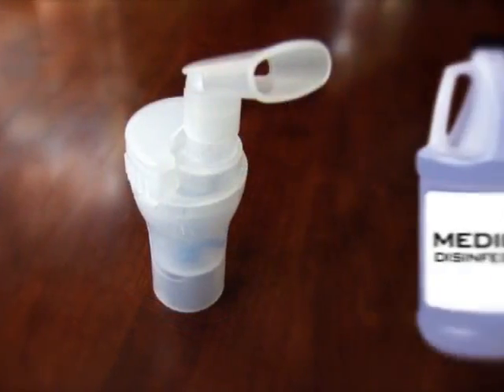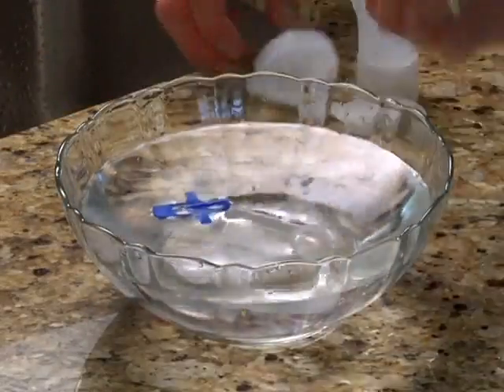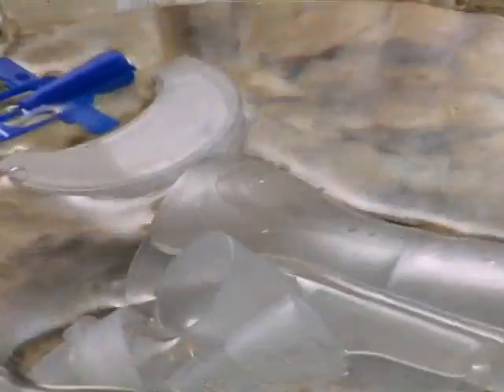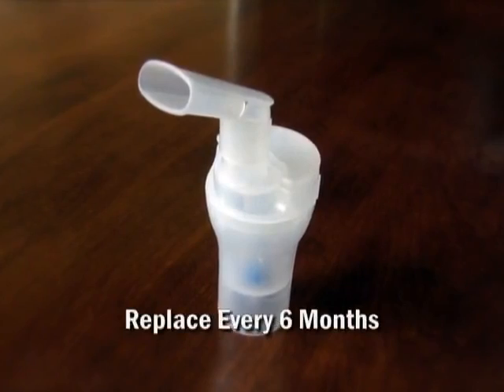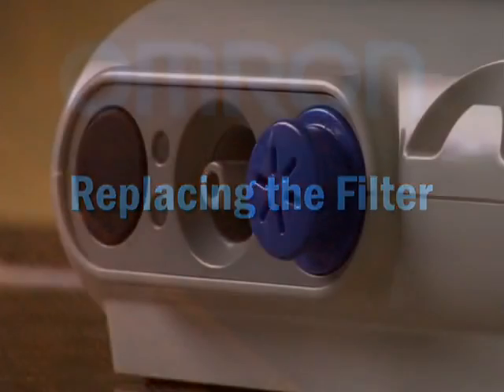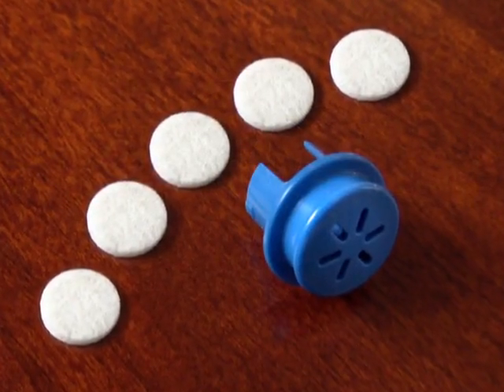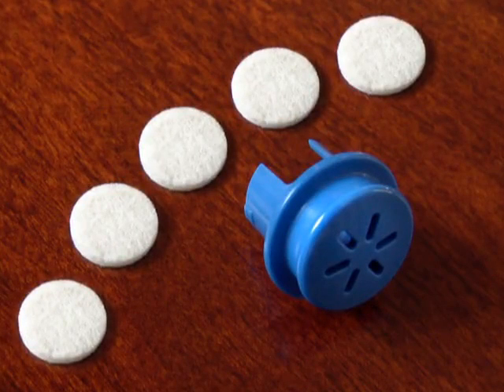Disinfect by using a commercial medical disinfectant. You can also disinfect by soaking the parts in a solution of one part white vinegar and three parts distilled water. The nebulizer kit should be replaced every six months. The filter should be changed every 60 days, even if the filter does not appear dirty. If the air filter appears dirty or has been dampened by water or medication, replace the filter immediately.